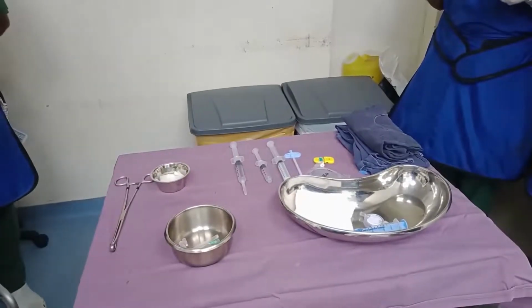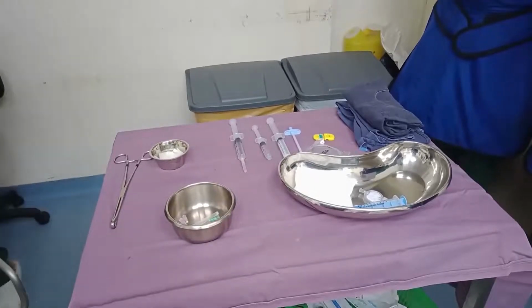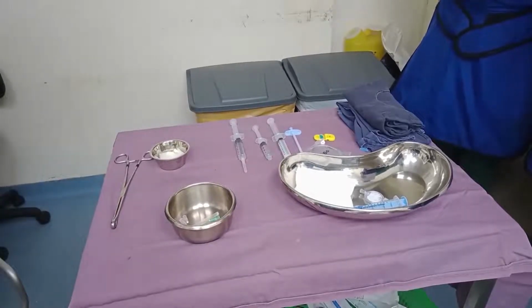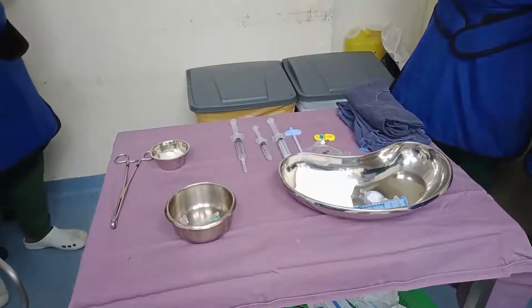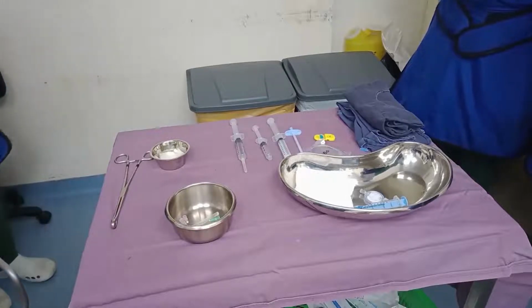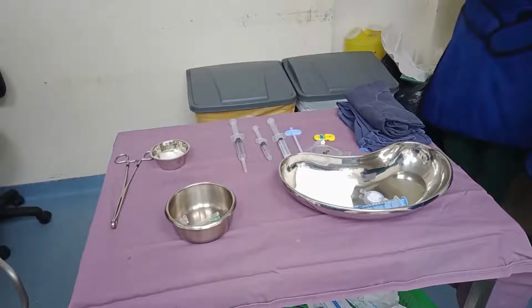So this is our procedure trolley. In this one, as you can see, there are medications which are syringe coded because we do not have sterile labels. The one that has this orange needle on it is 2% lidocaine, in a 10 cc syringe, to differentiate it from the syringe lying next to it, a 5 cc syringe. The contrast is taken. The other 10 cc syringe has triamcinolone 80 milligrams and normal saline. It is differentiated from the local because it is more milky or turbid in color.